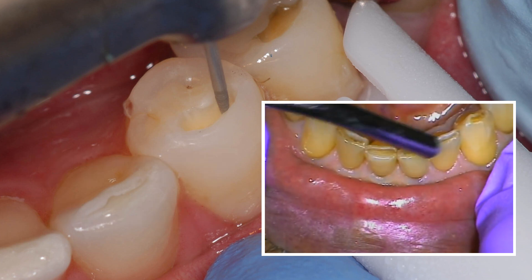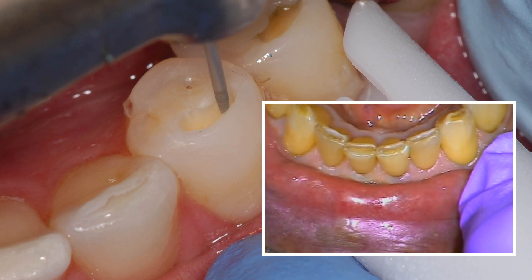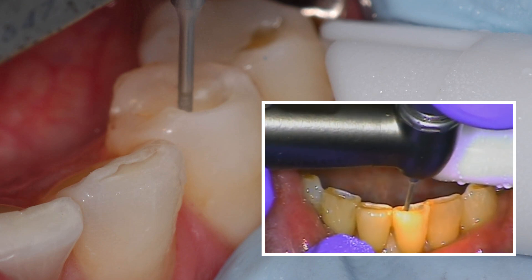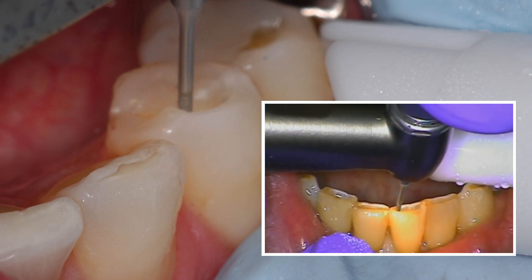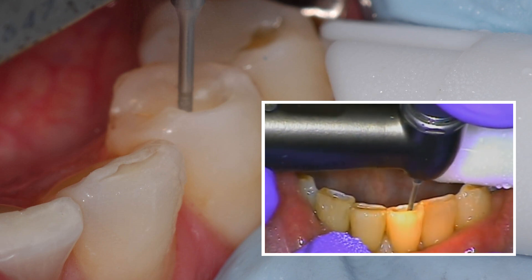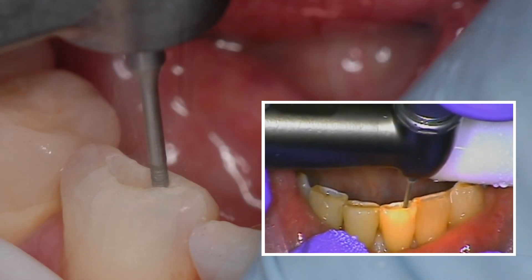This is the first prep. All I'm going to do is broaden out the base and clean out some excess you can see in there. I'll be able to do this cut because we're in the dentin. I'm just planing the enamel walls and trying to get out any stain or anything like that.